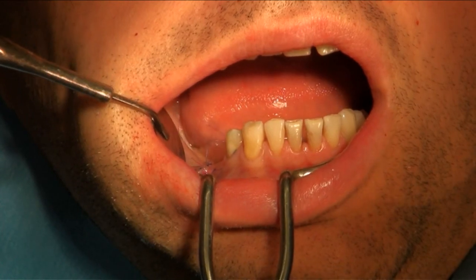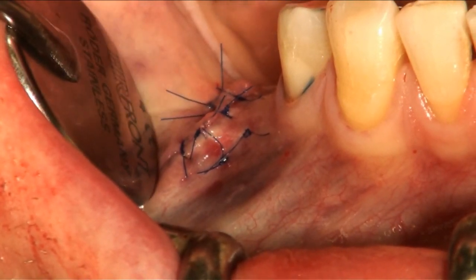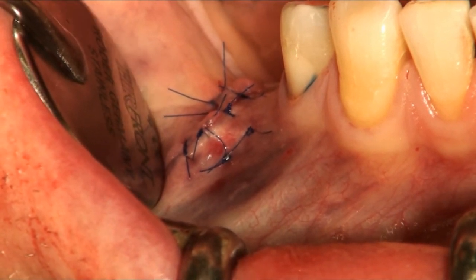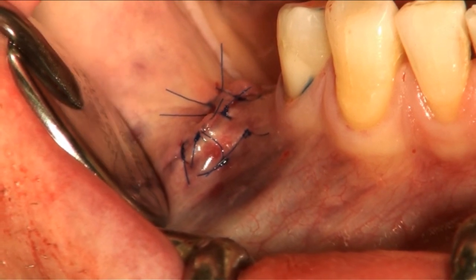This is the end of the procedure. We have a tight two-layered suturing, and the expansion of the expander starts now, and after 4 to 6 weeks of expansion we will do our block graft surgery.